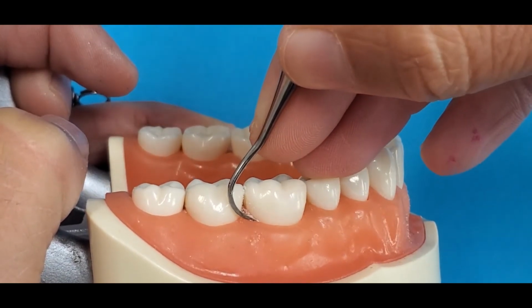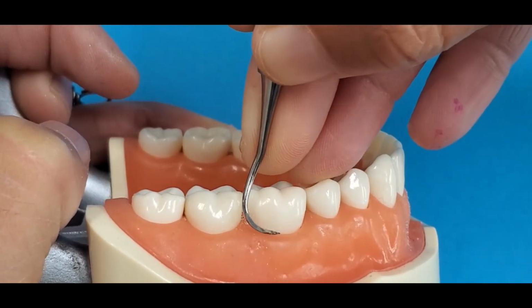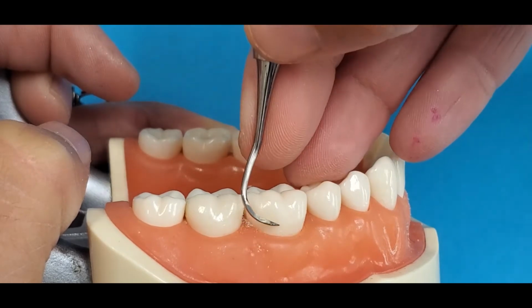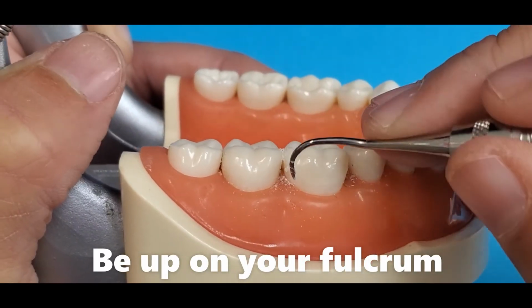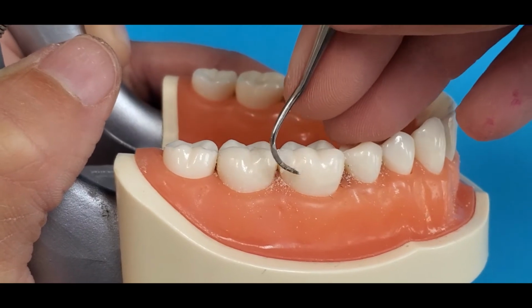You're going to use oblique strokes across the straight buccal. Now you can see that I'm fulcruming on the lingual. I'm up on my fulcrum and I'm pulling the instrument towards the tooth. Make sure you're up on your fulcrum for this part. If you're down, the tip's going to go towards the junctional epithelium, which is incorrect. So you fix this by coming up on your fulcrum.